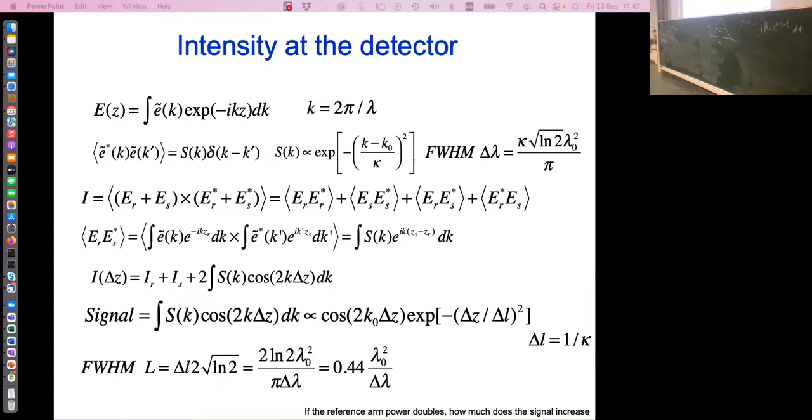Yes, increase the reference arm intensity. Because if you double it, the signal goes up by the square root of 2. And this is a beautiful phenomenon. It's called noiseless amplification: you can increase the signal. I worked with ASML, the company that makes the wafer steppers. I had to explain this concept of noiseless amplification to them, and now they're super excited about this approach for their controllers.